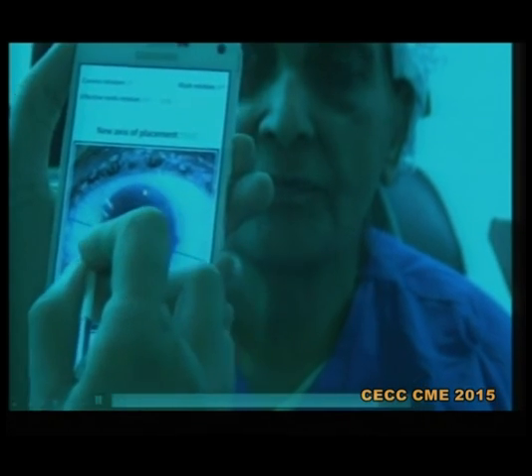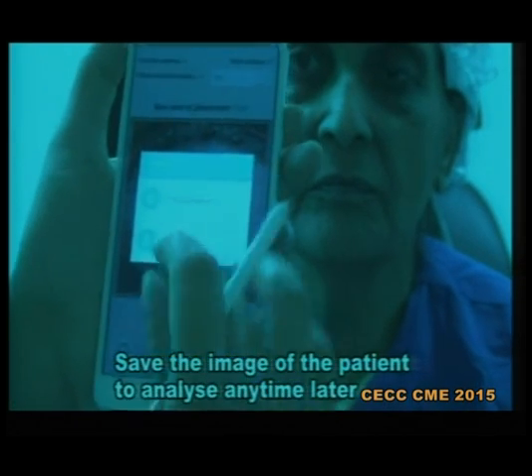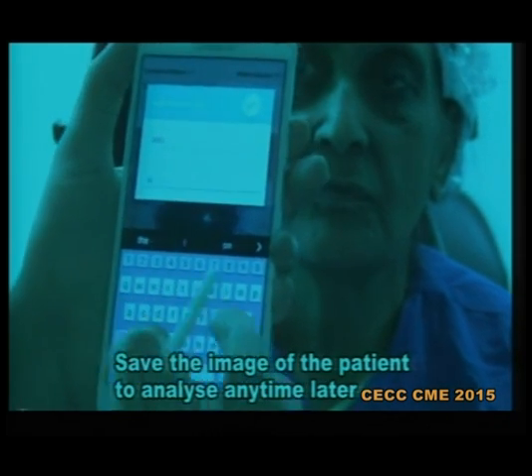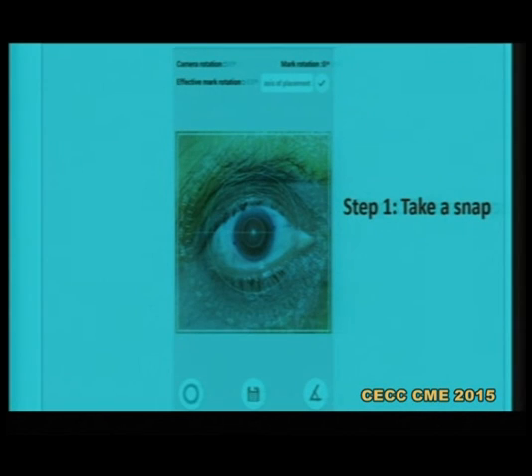You can also see the natural landmarks, and during surgery you can check whether a conjunctival vessel or something is nearby the marks where you want to place the IOL, and make changes accordingly. This application is available on the Android Google Play Store.